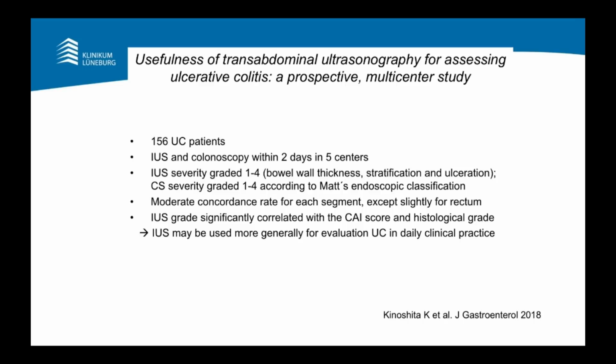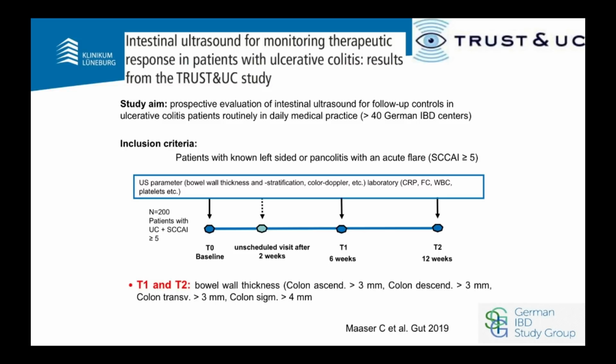Now, how about in a broad range of centers in a multi-center study prospectively evaluating the use of intestinal ultrasound? This is now a study from our own group performed in Germany with the aim of prospective evaluation of intestinal ultrasound for follow-up controls in ulcerative colitis patients routinely in daily medical practice. More than 40 German IBD centers participated in that study, and the inclusion criteria was patients with known left-sided or pancolitis with an acute flare, defined as SCCAI of 5 or more.